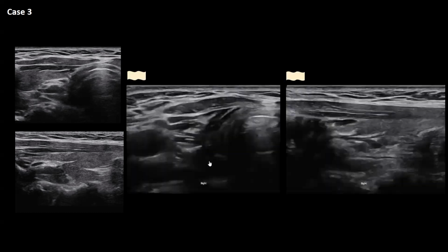In the third case, this patient had hyperparathyroidism and was referred from an outside clinic where ultrasound was reported as normal. On ultrasound, a hypoechoic lesion is seen posterior to the right thyroid gland. At first glance, it might be mistaken for thyroid tissue posterior to the septum, as in the previous cases. Let's review the transverse and longitudinal ultrasound videos.